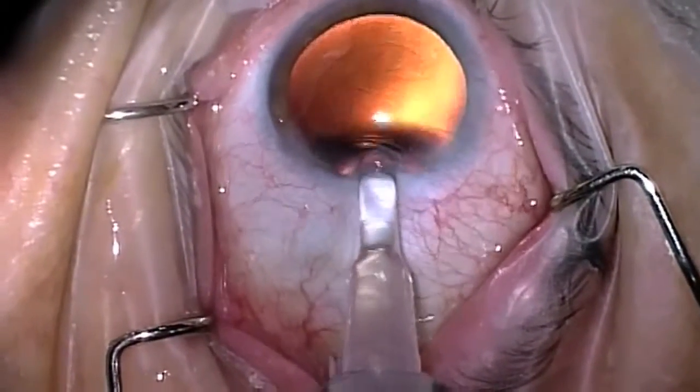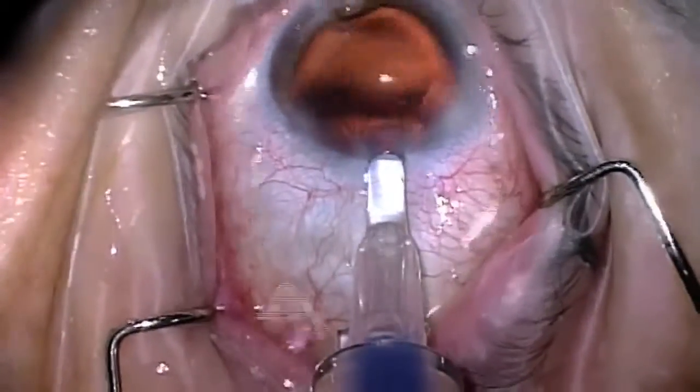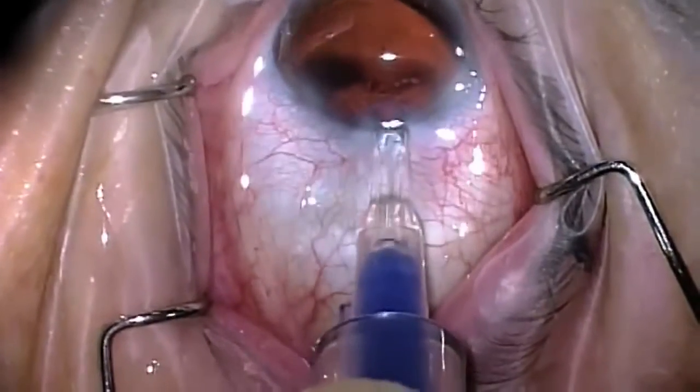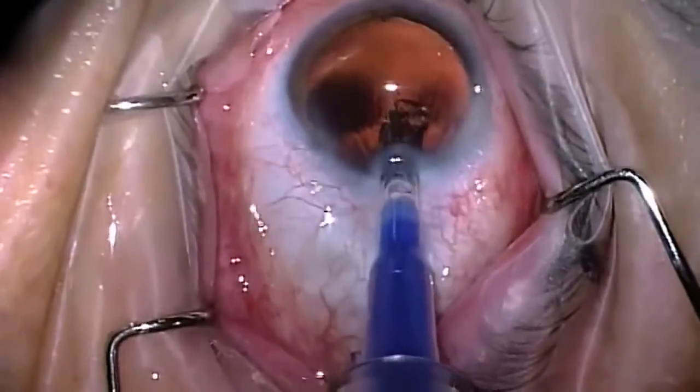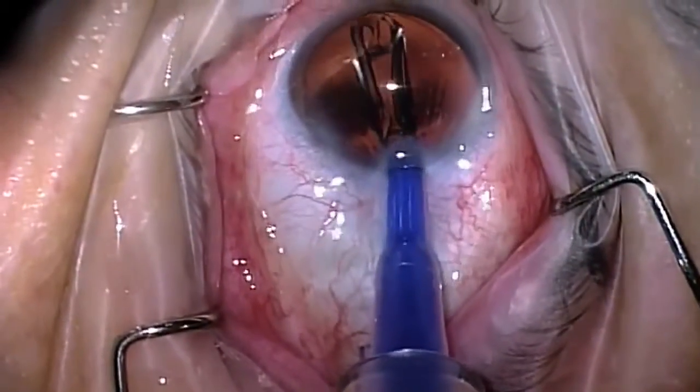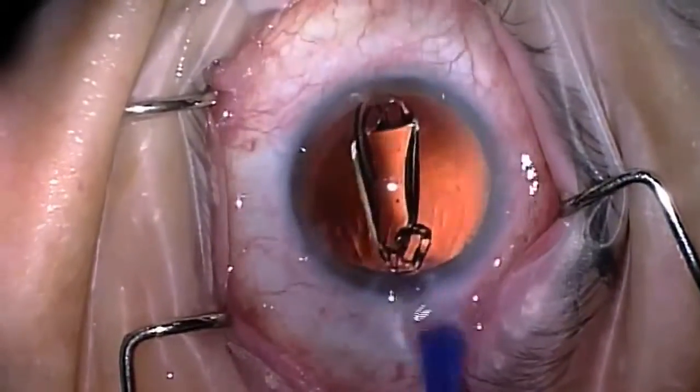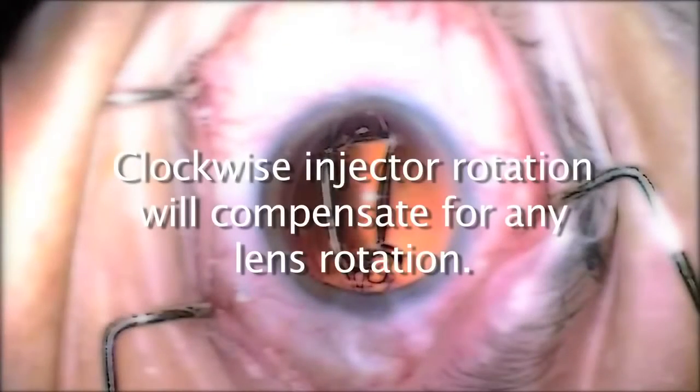With the conical tip bevel facing down, inject the lens by applying continuous pressure on the plunger until the lens is fully expressed from the tip. Clockwise injector rotation will compensate for any lens rotation.